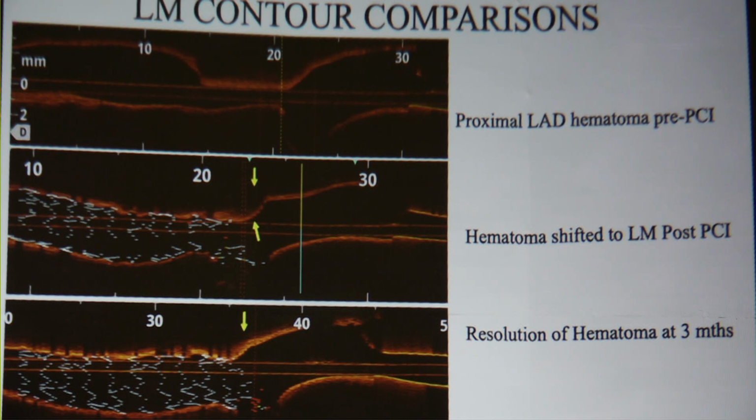So what was the MSA when the stent was first deployed? At the LAD ostium? MSA was good, it was more than 8. Then there was no need to touch it. Yes. First of all, there was no need to touch that. That is what I wanted to say.